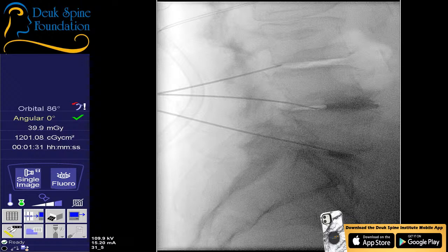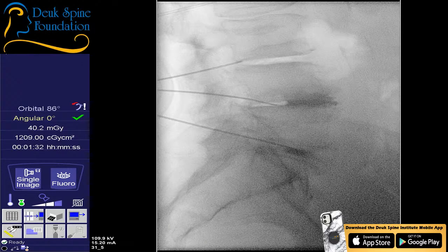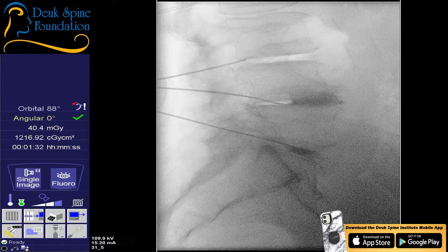Can you drop the fluoro more? Let's bring the table up half an inch when you get a chance, please. Good. Shot. I think we need a little bit more of some rotational component, maybe. Keep going. She may have moved a little bit on the table. Alright, that's good.